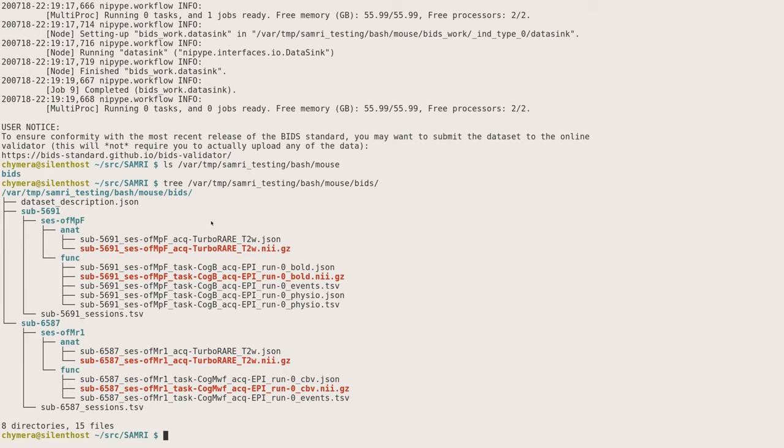Here you have your data ordered on the first hierarchical level by the subject, on the second hierarchical level by the session, and then by the various scan types. So if your goal was to just convert your data to NIfTI and also generate metadata files and parse everything in a directory structure where it's easily accessible for analysis tools or just for your visual inspection, you're done, but of course you can do more.